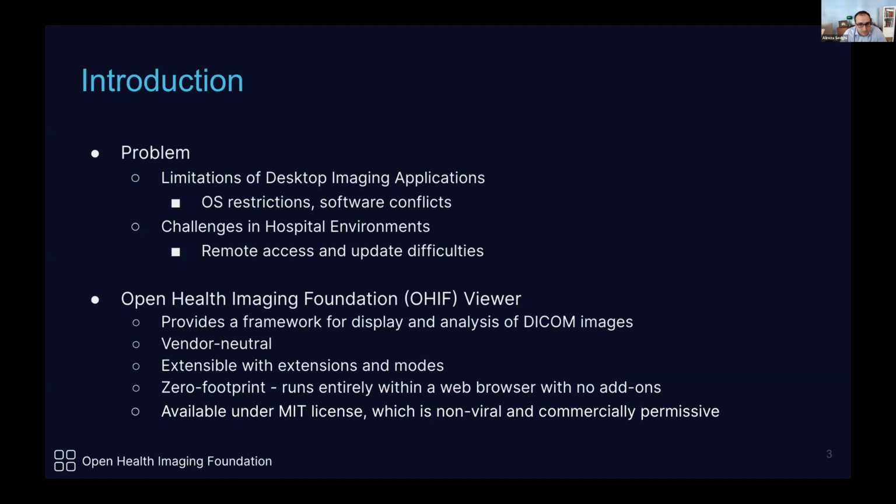So now enters OHIF as a solution, which is a framework for displaying and analyzing DICOM images. It's vendor neutral, so it works with every vendor. It's extensible with extensions and modes, making it super flexible. It's zero footprint, so no add-ons, just a web browser. And the MIT license keeps it open and accessible. So that's OHIF in a nutshell.